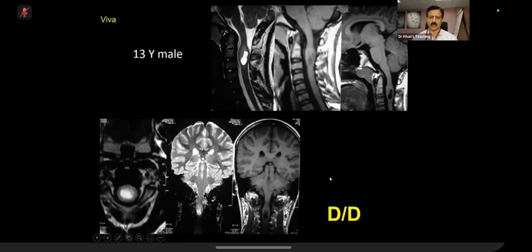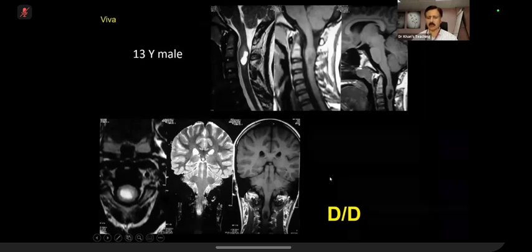That is the classical appearance, just what you see here. Otherwise, your differential is fine. So, astrocytoma up there, you are right. But even if you say that in the same description, then tell the examiner that because of this, it is less likely. And please also remember ependymomas, for example.